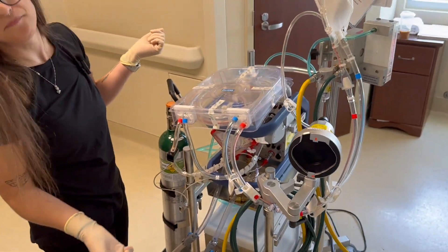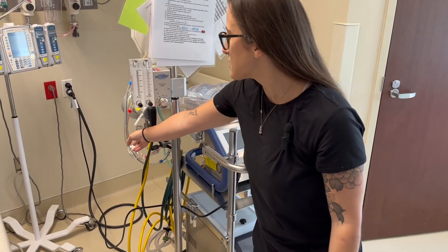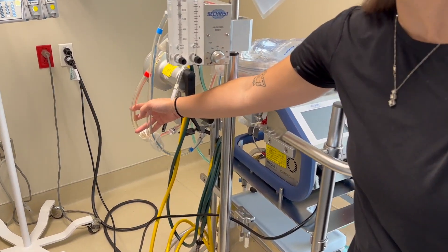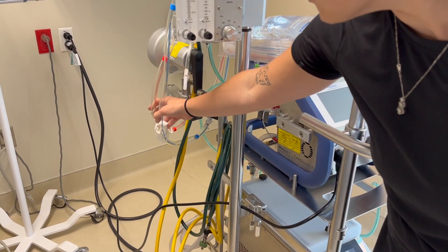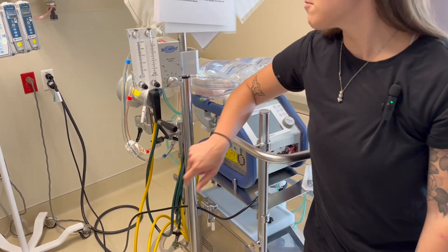This is a dry circuit setup. From our previous setup, we want to make sure that our Roberts clamps are clamped on our return line and our drain line — there are two Roberts clamps on each. So now we're ready to prime.